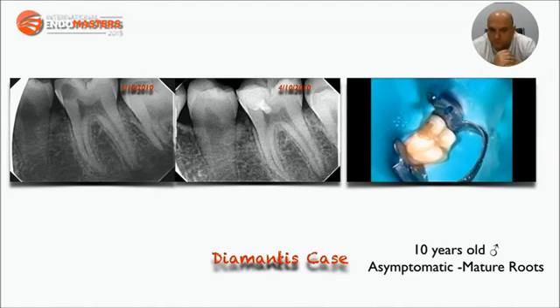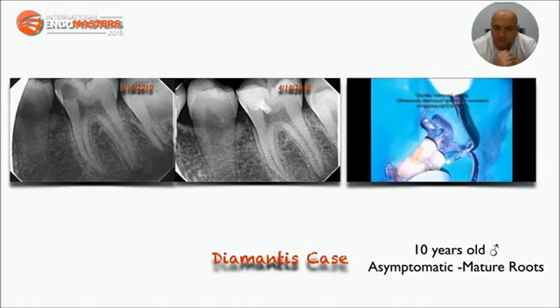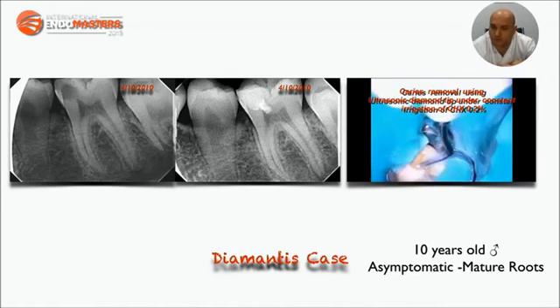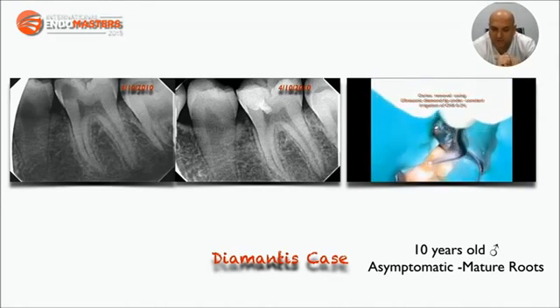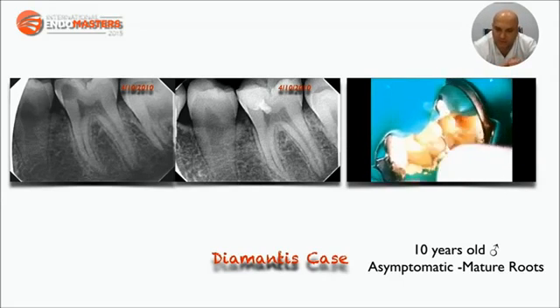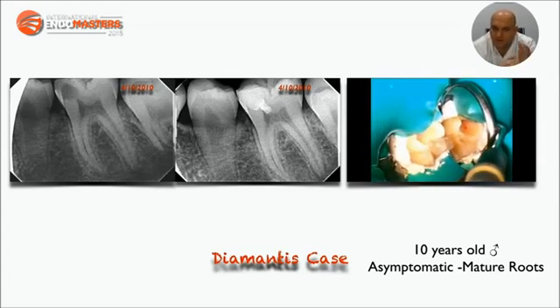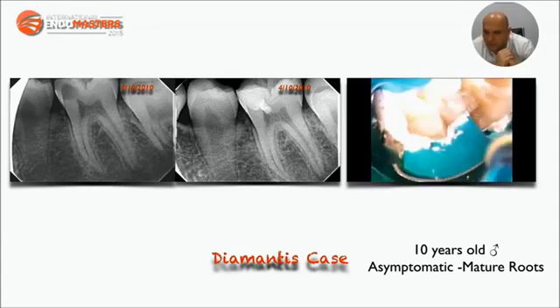Caries removal with a diamond-coated ultrasonic tip under continuous chlorhexidine irrigation. The ultrasonic tip was inserted 2 mm inside the pulp tissue. Bleeding was controlled with pressure hemostasis with a sterile cotton pellet embedded with chlorhexidine, and MTA was placed over the exposed pulp tissue. The first shot of MTA was mixed with the blood. The second shot was thicker, and the third one was allowed to set. Glass ionomer was placed over the MTA to protect it, followed by composite resin restoration, all in a single appointment.